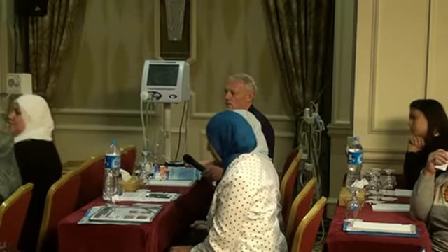Yeah, so I think that's a really good pragmatic point, and I will tell you that my experience is typically more with term babies, so I have less concern, and I just have less experience essentially with really fragile skin, as is the case with premature babies. I think the solution is probably to use an electrode belt that is not sticky. So there's no need to apply a sticky electrode that then, when you need to peel it off, is going to take some of the skin with it.